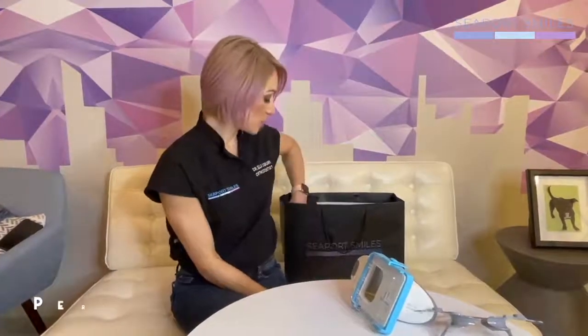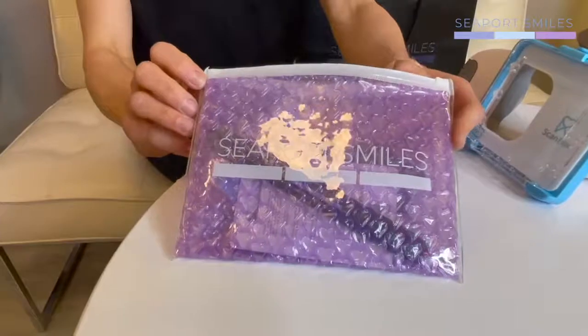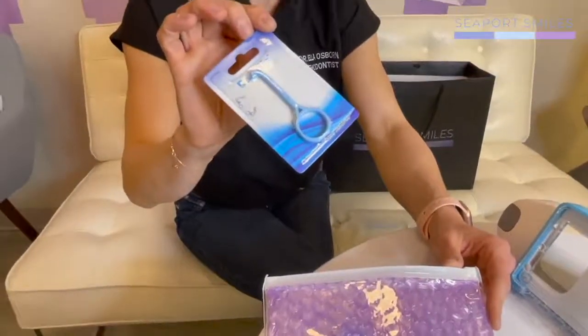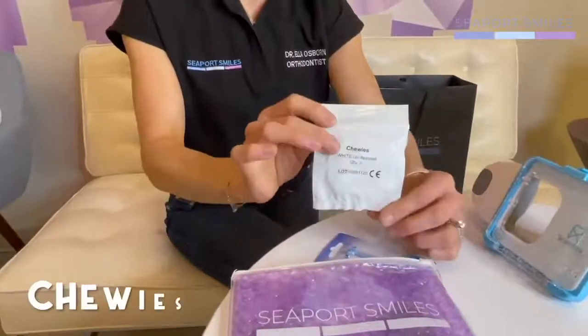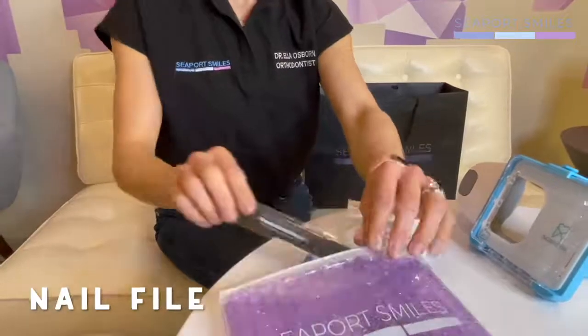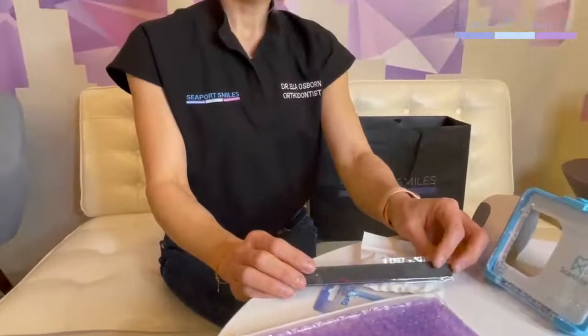You'll also get a personalized kit from us. In the kit is everything you need to troubleshoot any kind of discomfort you may have. First is the aligner removal tool — the little hook that makes it much easier, especially at first, to take your trays in and out. You'll also find a packet of chewies, and we've just discussed how to use them. You'll find a nail file — this nail file is to adjust any rough edges in your aligners, which is very common once in a while. Part of the tray may be a little sharp, and you can use this just like you would on your nail to make it smooth.